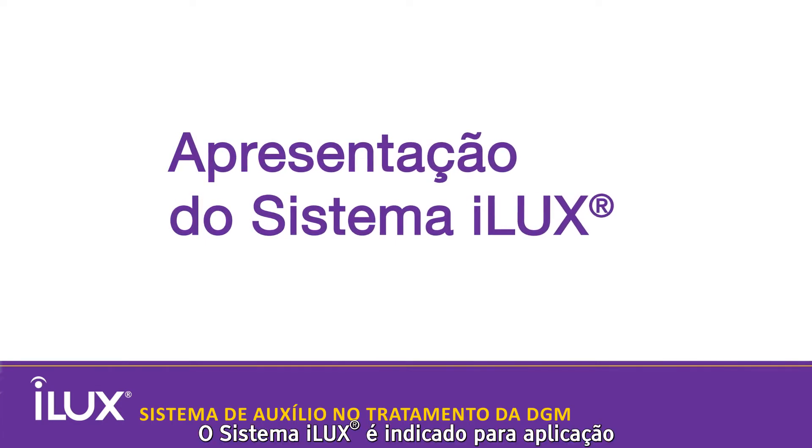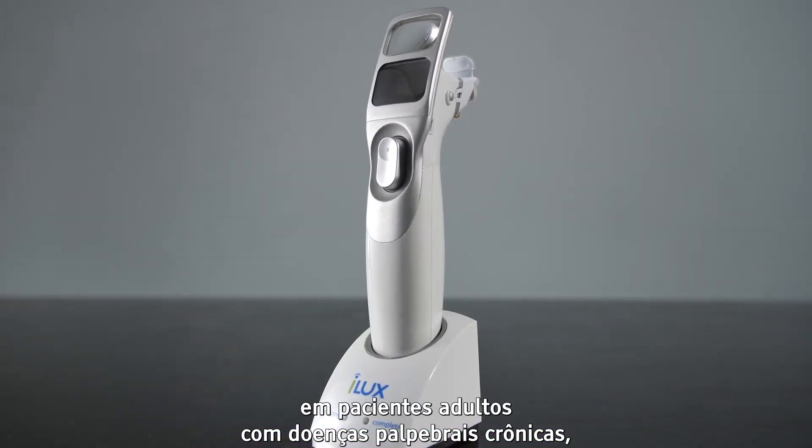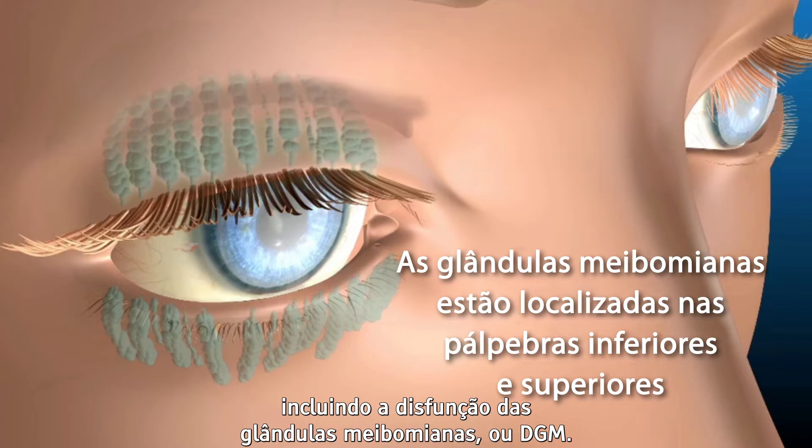The ILUX system is indicated for the application of localized heat and compression therapy in adult patients with chronic disease of the eyelid, including meibomian gland dysfunction, or MGD.